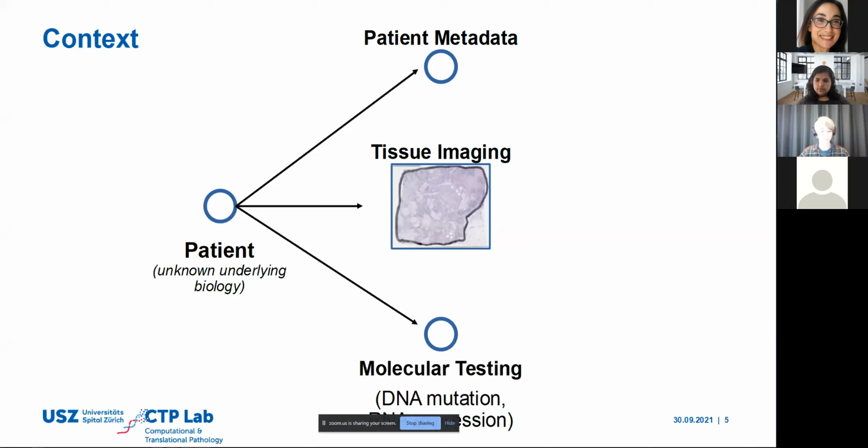So this is typically done by collecting as much information as possible, from general information about the patient, but it is also routinely done to analyze tissue samples under a microscope, where a pathologist is going to classify and categorize the tissue sample by defining what cancer type it is, by finding specific biomarkers to give it a grade and establish the status of the margins.